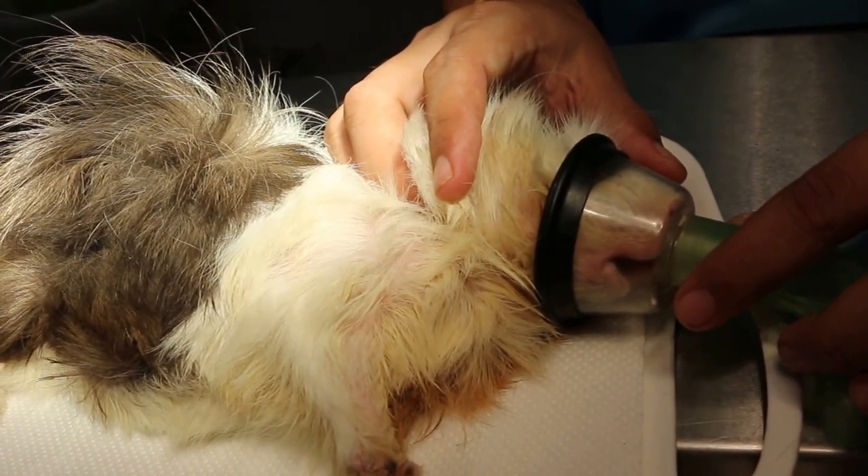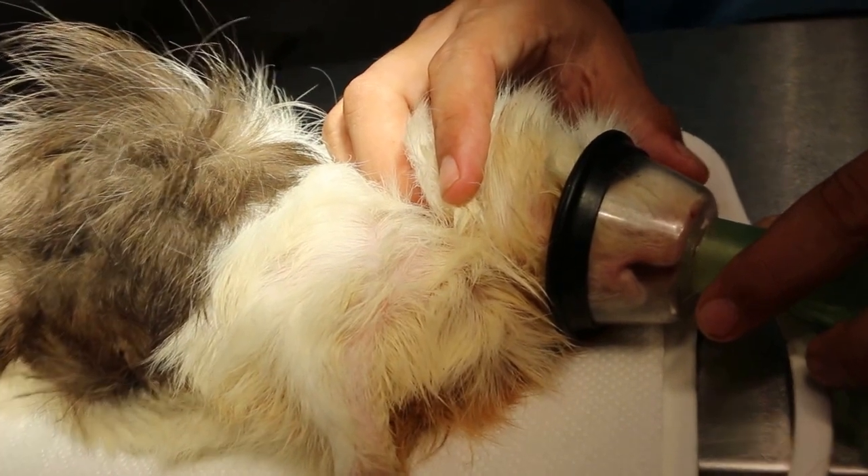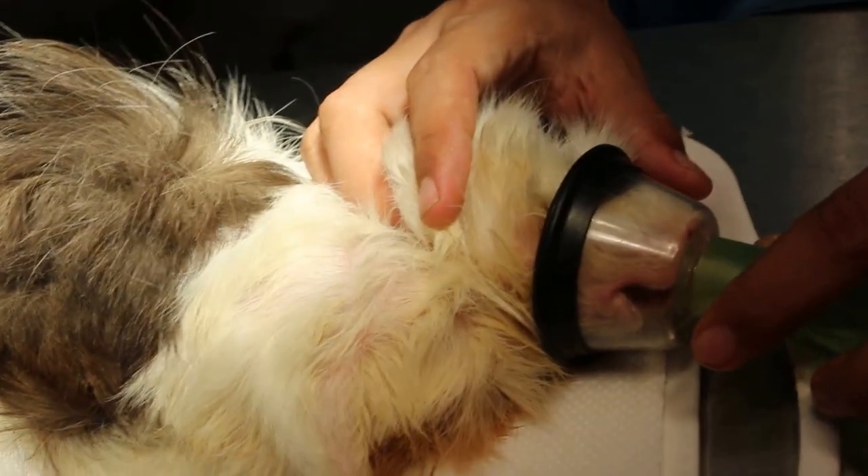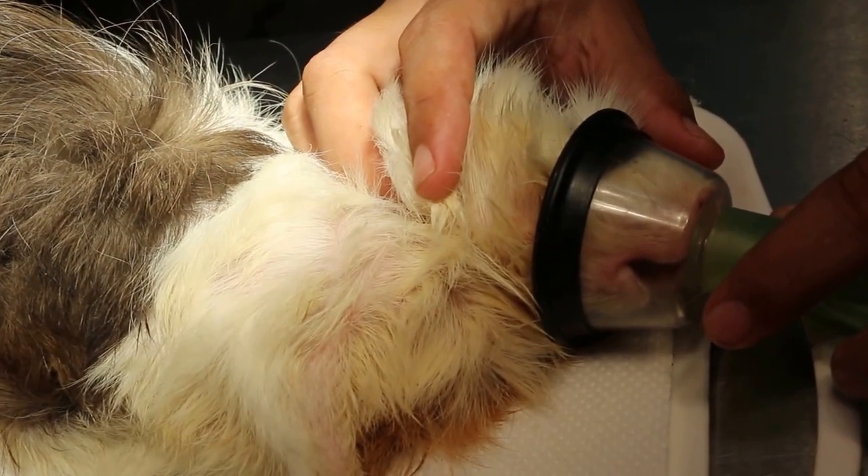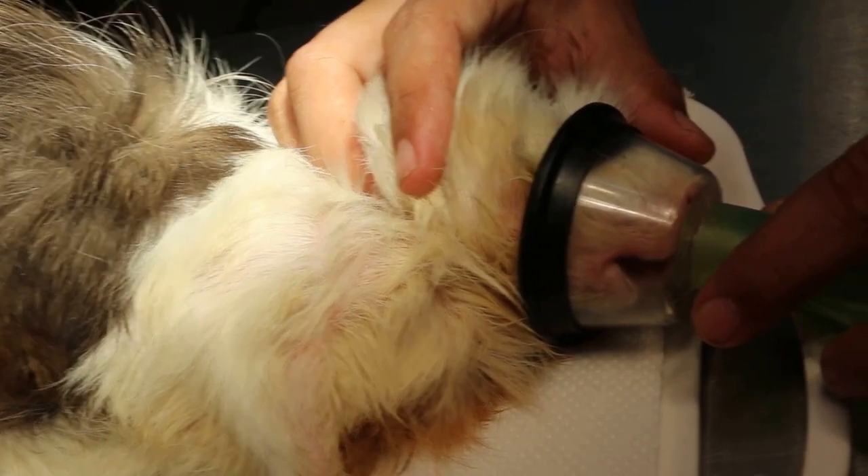This is Tuesday, December 1, 2005. Just now you saw the video — the rabbit, the guinea pig had overgrown front teeth, the incisors.